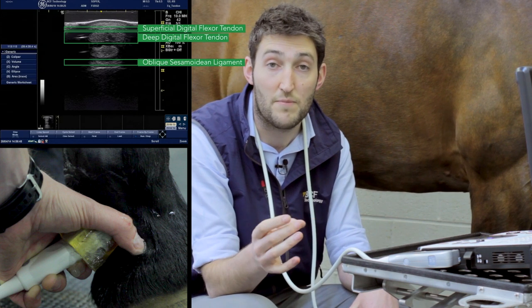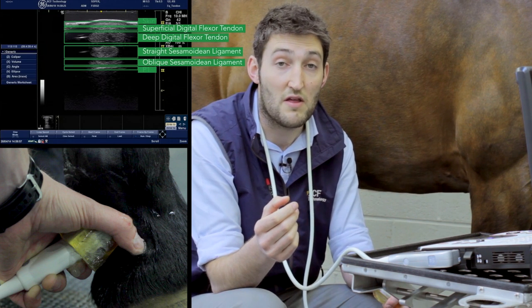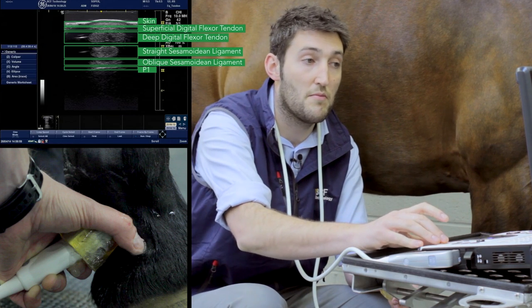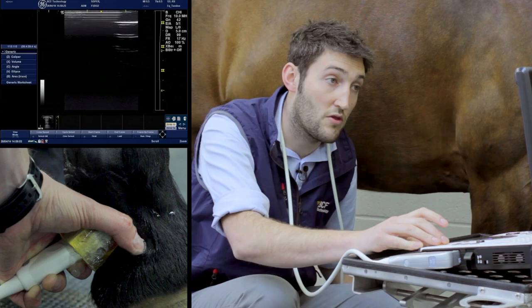It forms a sort of dumbbell or peanut shape and will end up splitting into two separate branches. Otherwise, the anatomy we're seeing is fairly similar to the more proximal zones. Last but not least, we'll drop down to zone 2A.